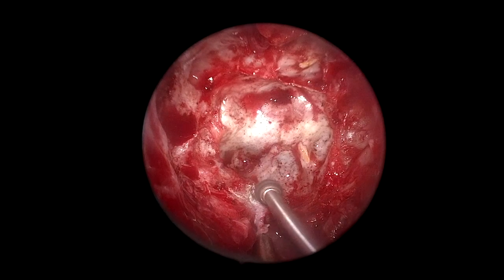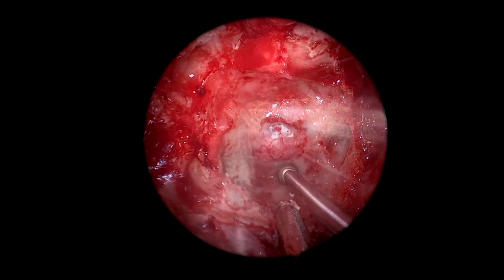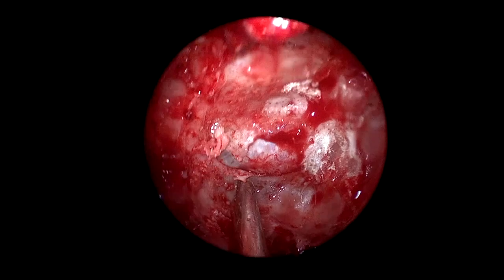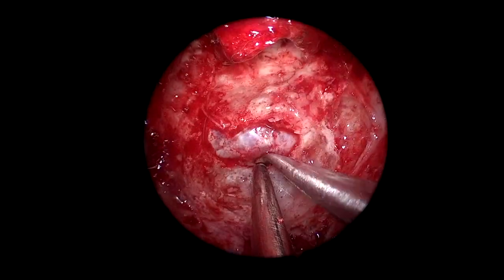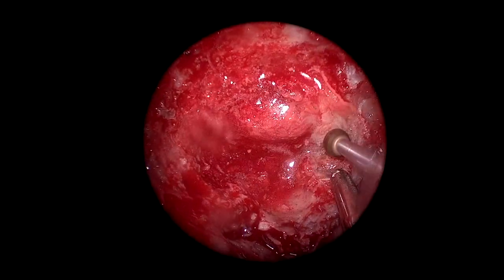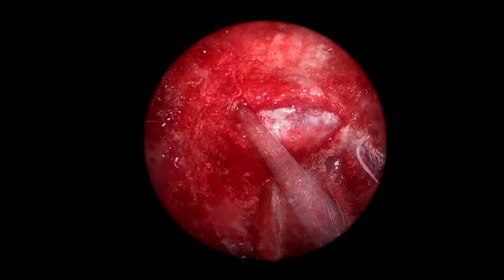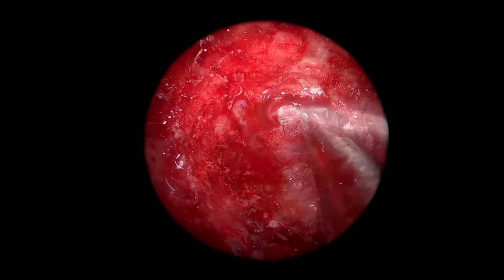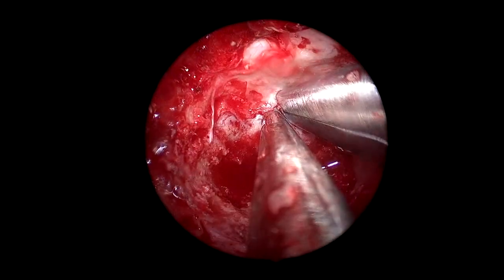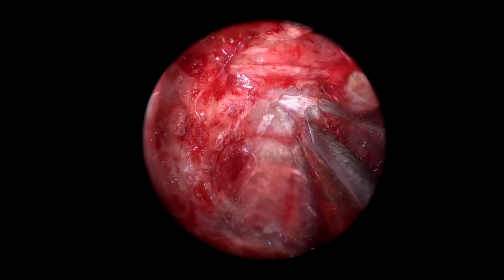We have now started the operation, raising a nasoseptal flap and opening the sphenoid sinus bilaterally, removing the bone covering the dura of the pituitary gland, and drilling the tuberculum sellae area. We extend our exposure all the way lateral to expose the anterior wall of the cavernous sinus. The floor of the sella is also exposed. Drilling goes along the anterior wall of the cavernous sinus to expose the clinoidal segment and expand the approach laterally. We then drill across the tuberculum sellae into the prechiasmatic sulcus and toward the limbus of the sphenoid, which represents the anterior landmark of the exposure.